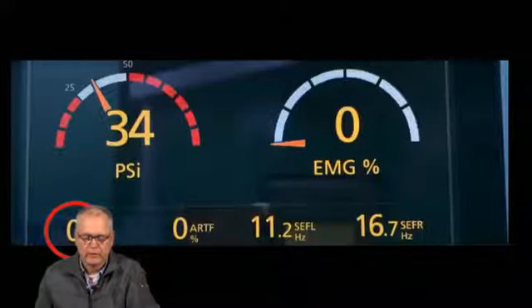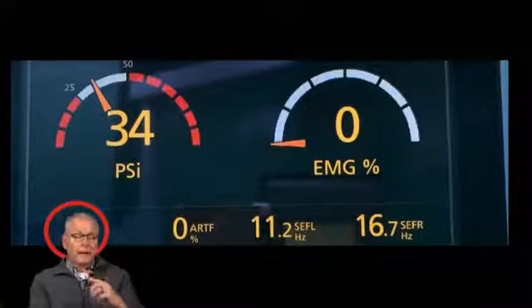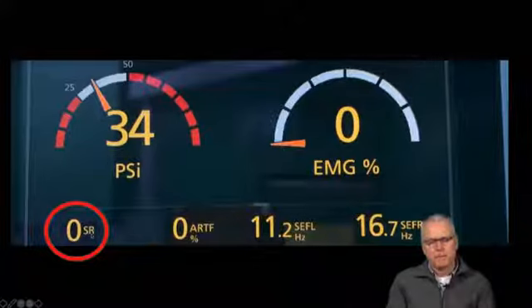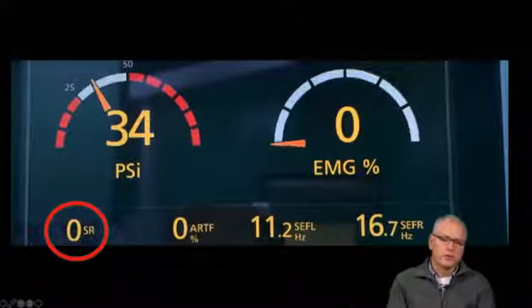Here's something interesting. Getting back to that burst suppression, it's presented on EEG monitors using the term SR, suppression ratio. That's a ratio from 0 to 100. In this particular instance, it's 0. To be honest, I think this is where you want to live. You don't want to be dosing your anesthetic so much that your suppression ratio is greater than 0.